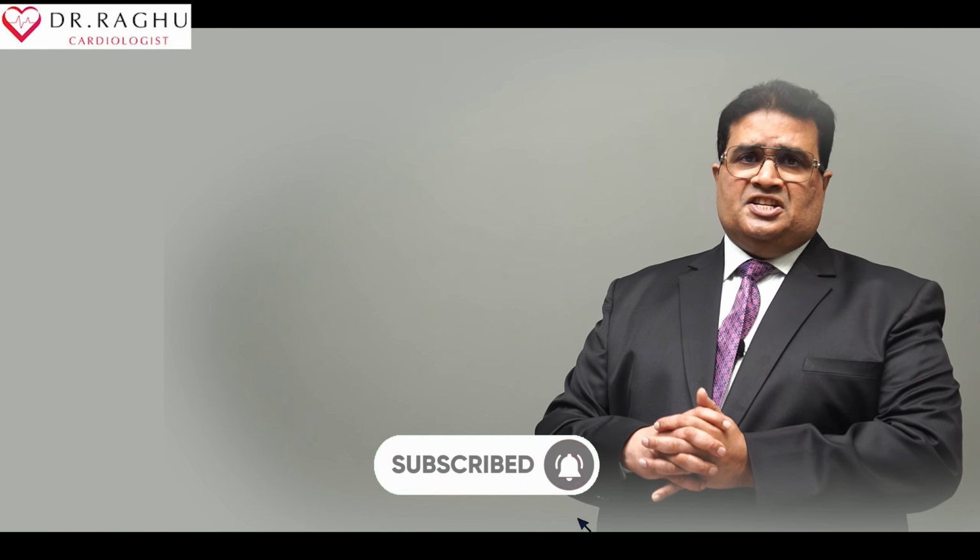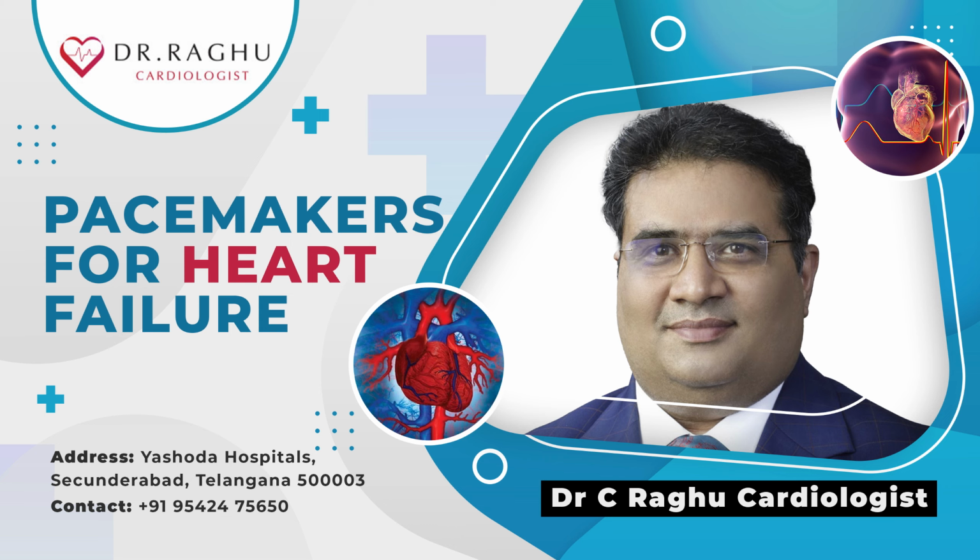Small studies have shown that this modality of pacing is even superior to the 3-lead pacing, or the traditional cardiac resynchronization therapy pacing, which is still being done even now.